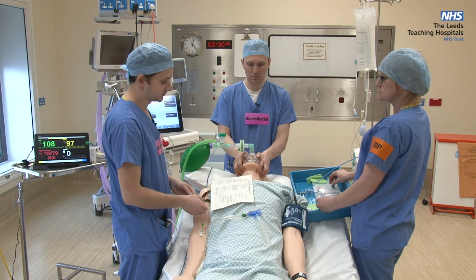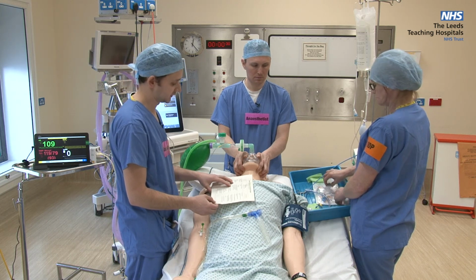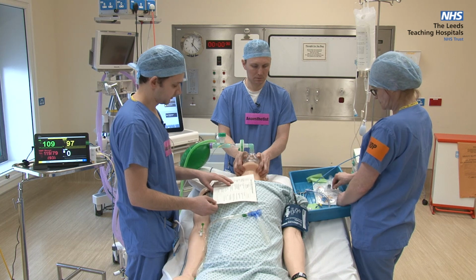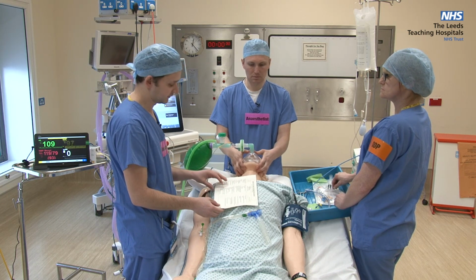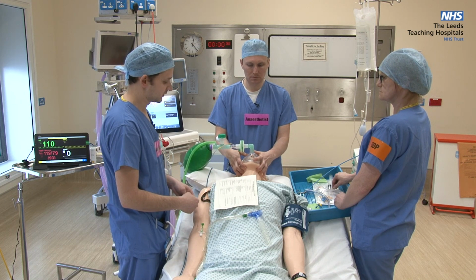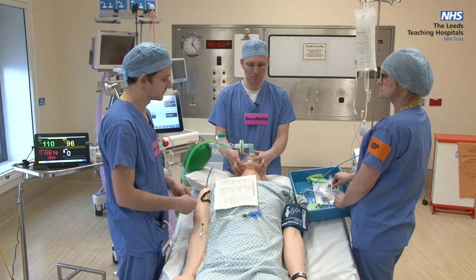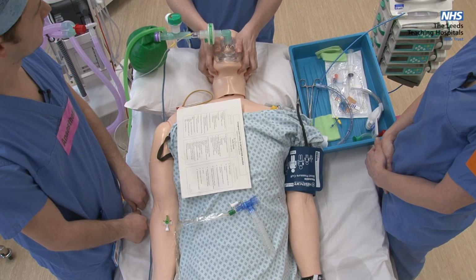Okay. The assistant number 2 is going to prepare the endotracheal tube, syringe, and make sure it's lubricated. Once the pre-oxygenation has been completed, the intubator will announce the induction, and the first assistant will be indicated to give the drugs. Okay, so the pre-oxygenation is complete, so you're going to give the drugs now, please.